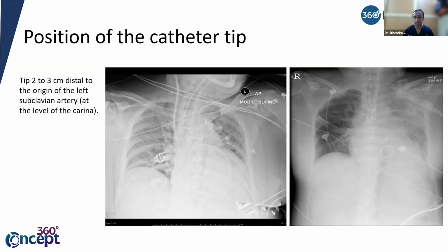Other than this, in this image, it's a radiology question. Okay, so there are other hardware. I'll not be commenting on the other hardware, but with respect to IABP, the first one is too far inside, the second one is too far outside. So you should adjust the position. This may be asked in your exam. The tip should be at the level of the carina.